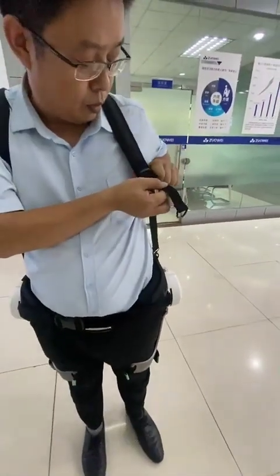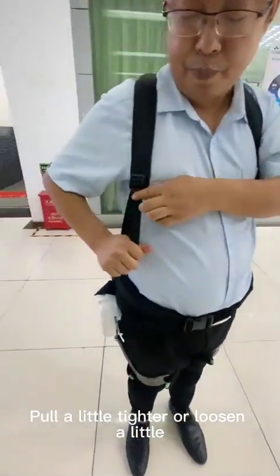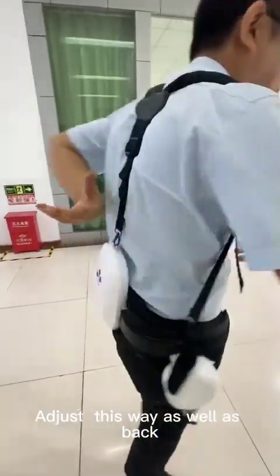Then these two — you can pull, depending on your height. Pull a little tighter or loosen a little. Adjust this way as well as back.